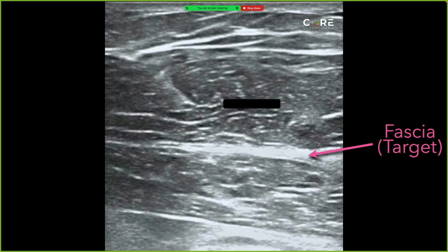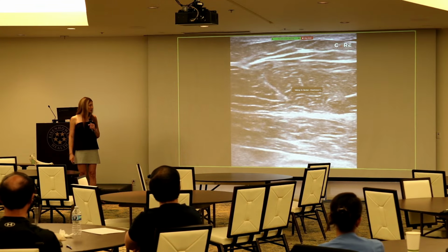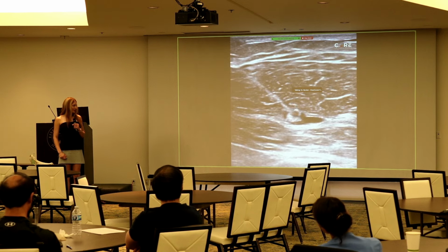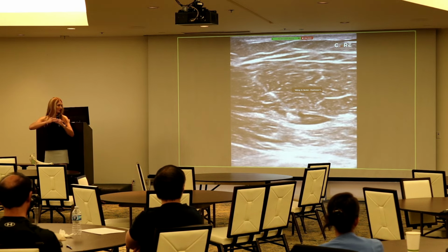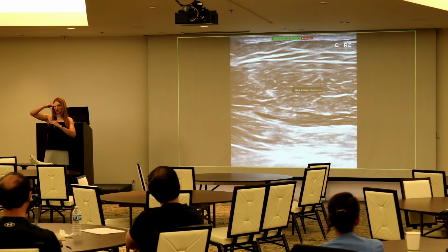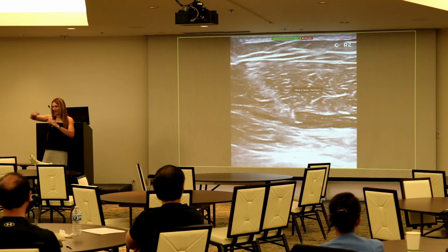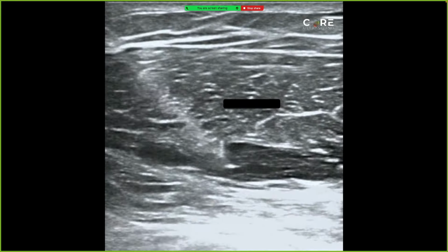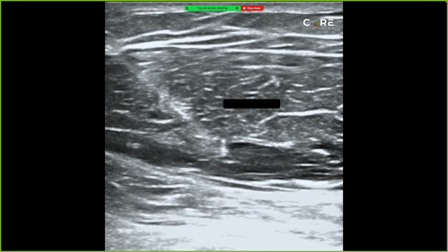Always follow those. Now, we're not targeting a nerve. This is probably a review for a lot of you. We're not targeting a nerve. We're targeting the fascial plane in which the nerve lies. This is a PEC 2 block that I did a while ago for chest pain. What we want to see, right next to that hyperechoic fascial plane, is the anesthetic unzip the 2 muscles, basically. We want to see it spread along that fascial plane. If we don't see that nice unzipping, we are in the muscle belly or in the nerve. We should stop injecting, reposition, and then inject again.